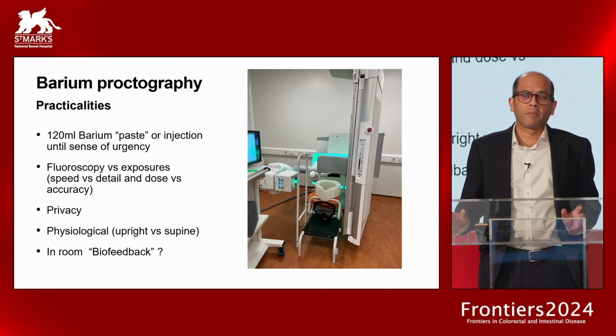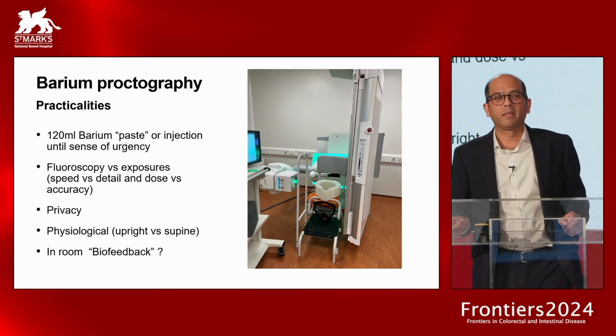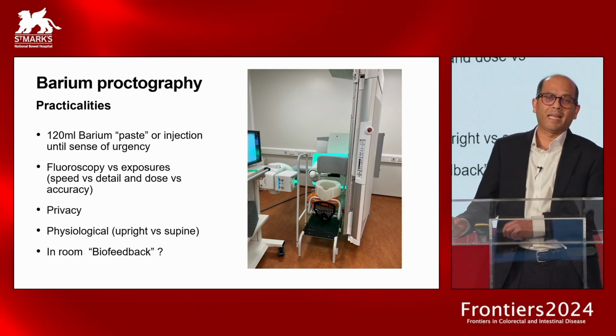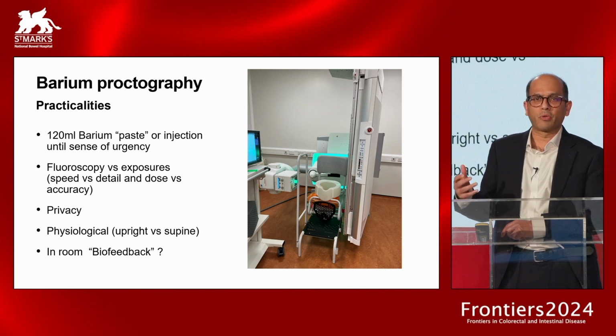So in broad terms, the advantages of fluoroscopy, you can get a much higher frame rate. So you can imagine it akin to getting a video clip as opposed to taking a series of rapid photographs. So the advantages with fluoroscopy, then, you can get a higher frame rate. So our machine, for example, will give us up to 7 frames per second, whereas typically with exposures, partly because of dose, but partly also because of other technical reasons, you would typically get a frame per second.